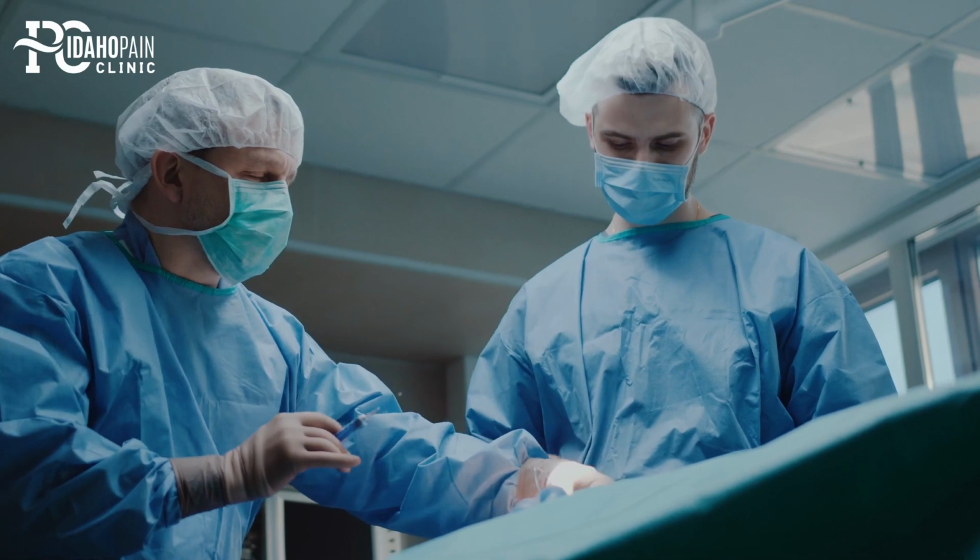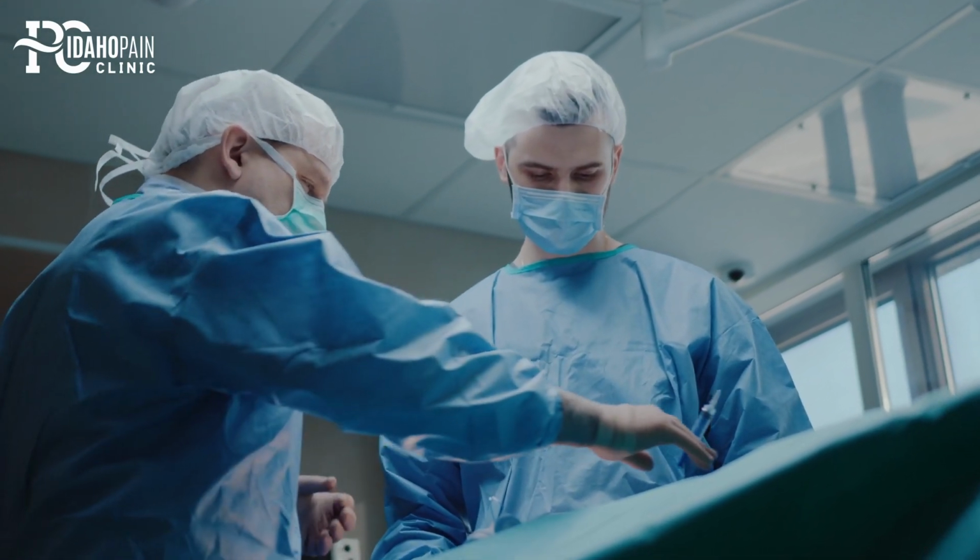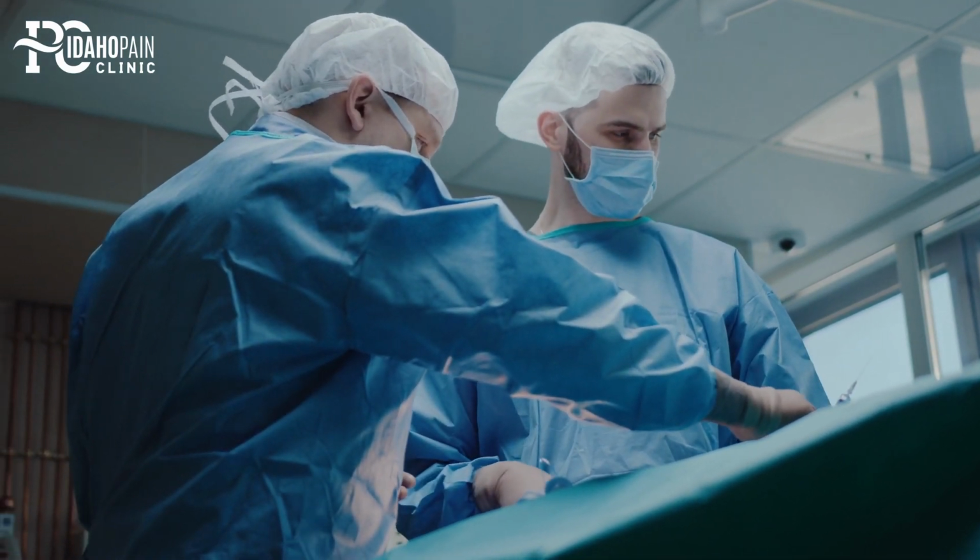Number two, it's minimally invasive. Compared to spinal surgery or other types of surgery that may permanently change the anatomy of your back, where they remove parts of your backbone if they do a laminectomy or a fusion, this is minimally invasive in that you do get a lead implanted, but you're not changing the anatomy of the spine.